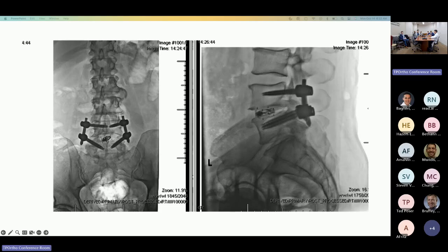The companies that have navigation platforms like 7D or Medtronic have developed all the workflow and the tools so you can navigate all the instruments. So you kind of have to use a graft that's made by one of those companies, I think, to enjoy their whole procedural solution. But it is really nice.